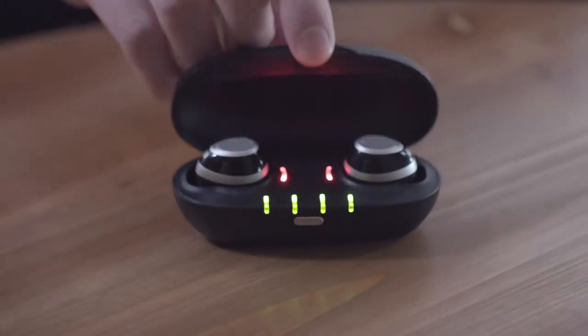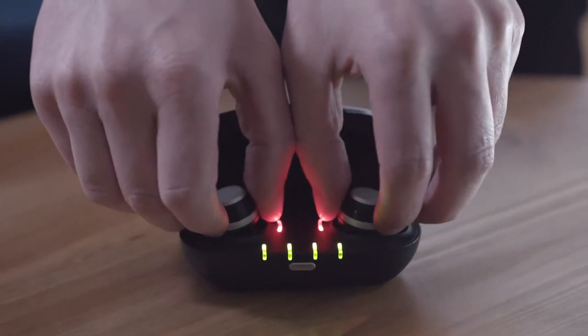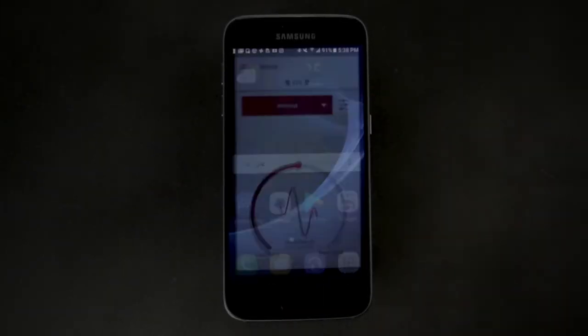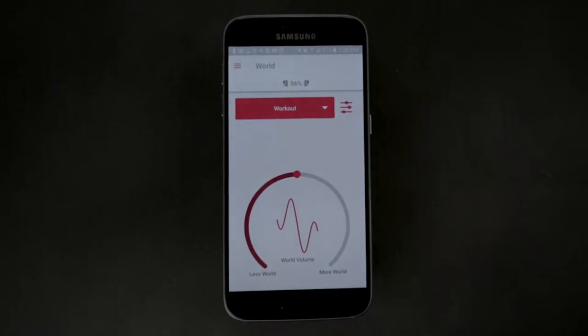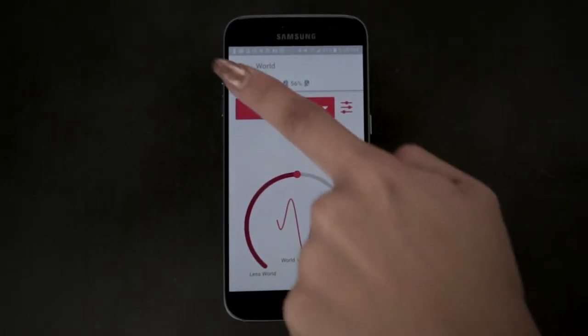In this video we will be showing you how to set your personal profile. When you get your IQbuds, it's essential to first configure your personal profile settings in the app.